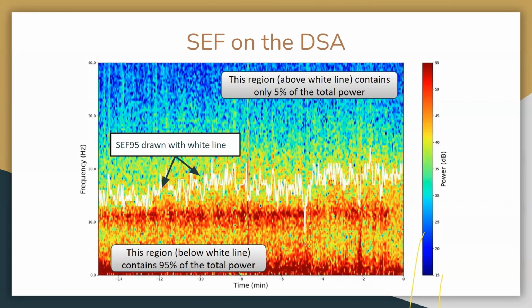Yeah, so we were just saying that the area under the curve is where most of the waves actually are. Is that correct? Yeah, power explicitly represents the energy delivered over time. How much energy is being delivered at a certain amount of time? So in the sound analogy, it is loudness, right?